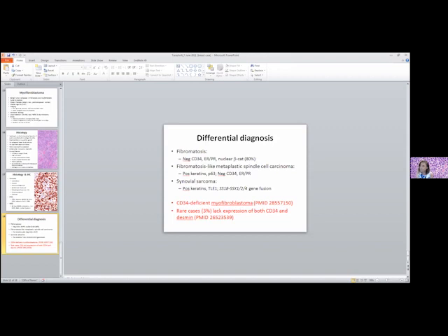And I would say that myofibroblastoma in a way was a diagnosis of exclusion until I got the RB1 IHC result. However, diffuse ER would have been unusual for metaplastic carcinoma, right? So it's just something didn't make sense, and you have to do all the stains.